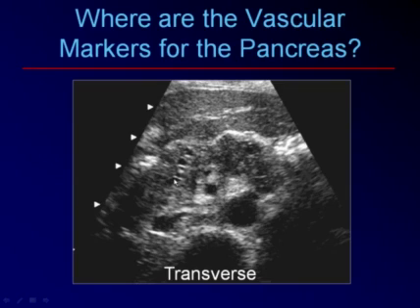And now you know exactly where you are, and in front of that should be the splenic vein, which we can't find. Instead, there's some lumpy, lobulated, solid tissue with small cystic spaces, and this turned out to be a diffuse pancreatic cancer involving the gland and already invading the splenic vein.